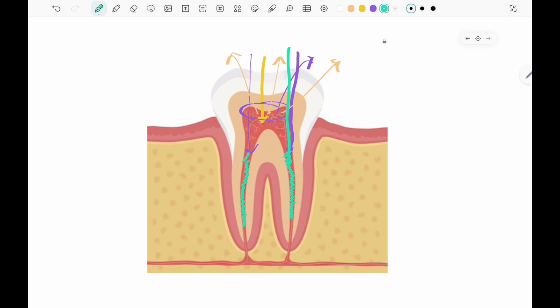You never give it in the coronal part. You aim the needle into the canal and then deliver the anesthesia. And it is normal for the patient to have pain during the intrapulpal anesthesia for the first 2 to 3 seconds or 5 seconds. After that, the patient will cooperate very well because the pain is gone very instantly.